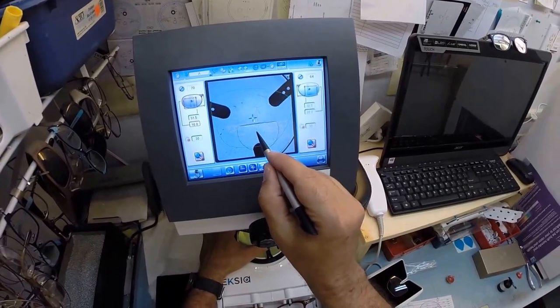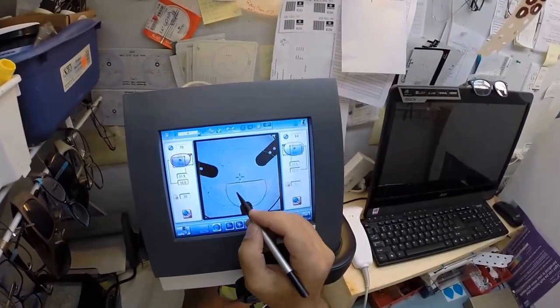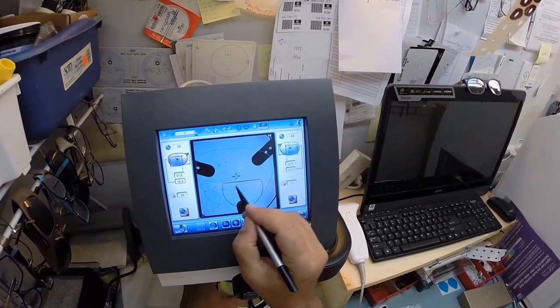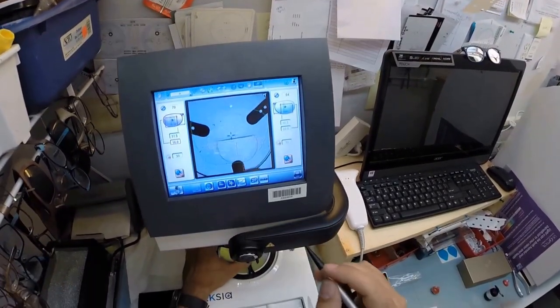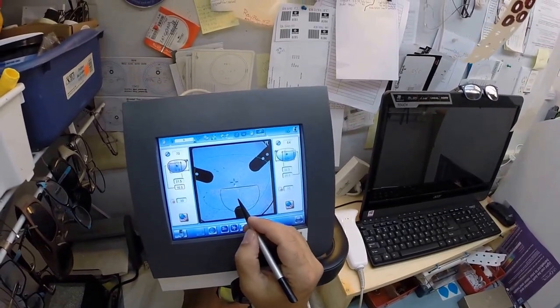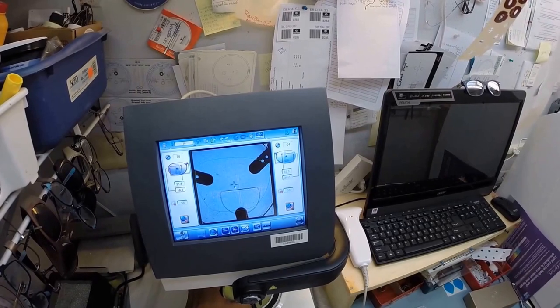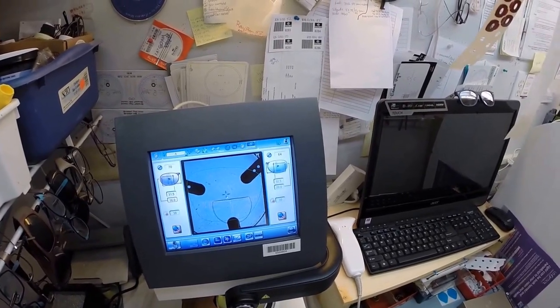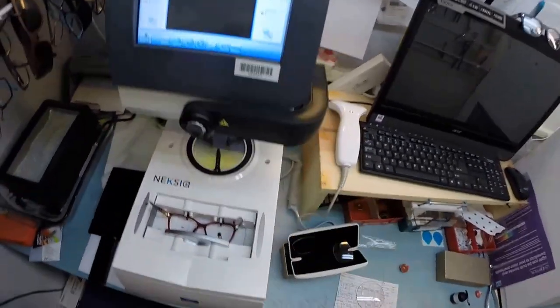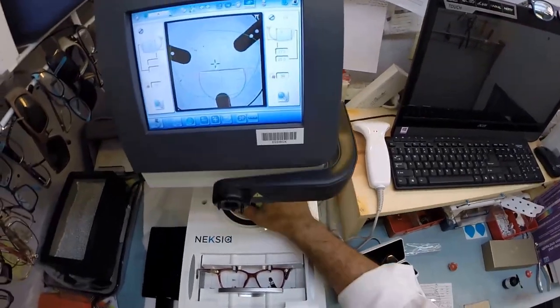This actually has a little line on here. Whoa, it's a wavy boat in the ocean. But I'm going to get it lined up on that orange line inside these two grids. If I move it away, this point and this point are the width of the segment, as we call it. So I'm going to get these lined up in there where everything is just perfect. Come on now. And hit the button, the block comes down, and now the block has been applied to your right lens.